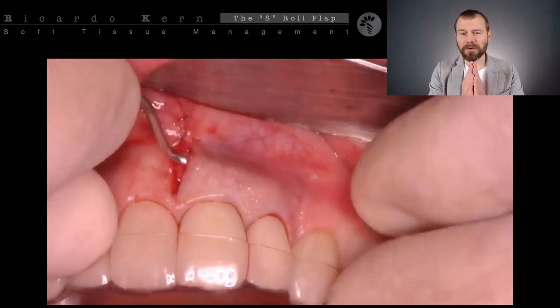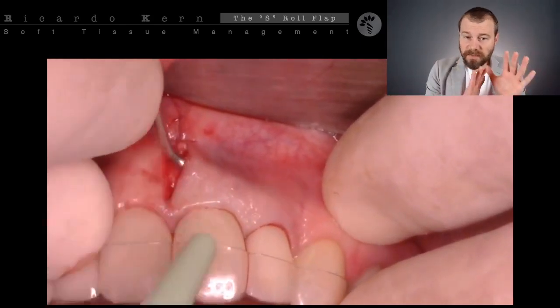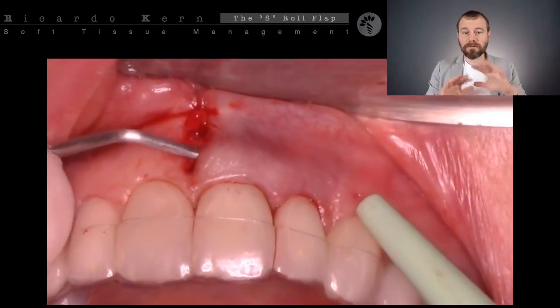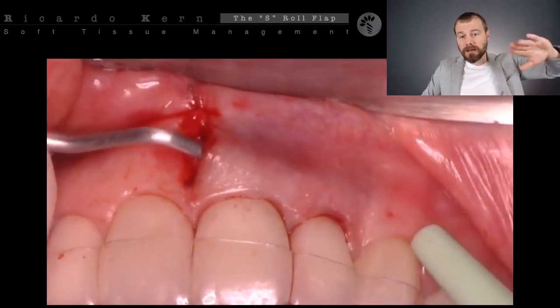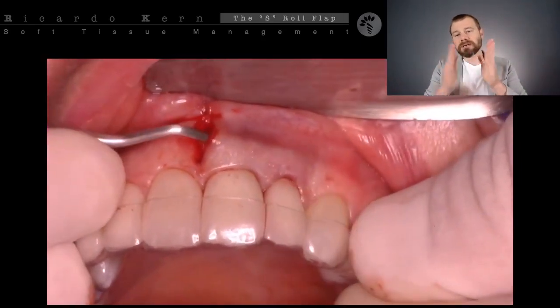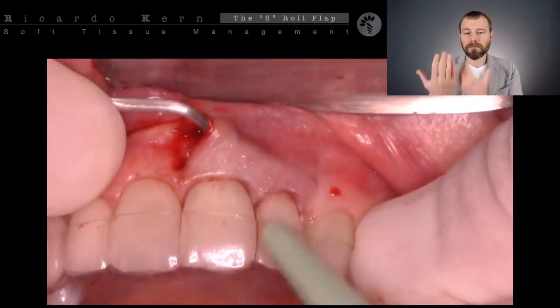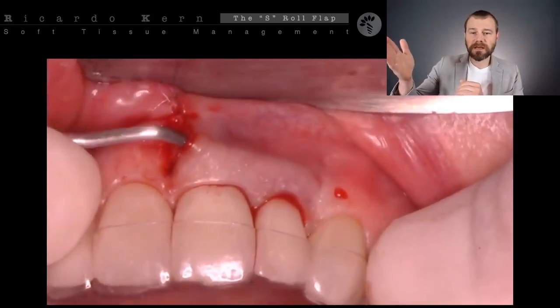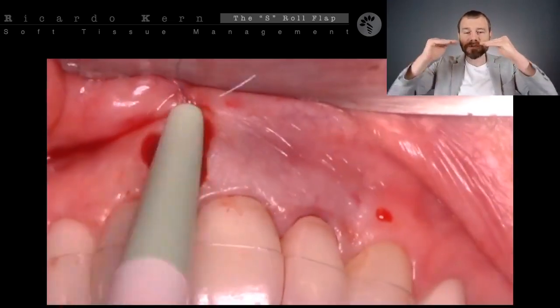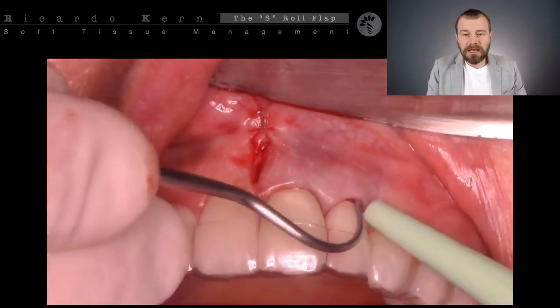And from that point on, natural roots, full thickness or split thickness. Go full thickness, okay? It's easier, safer for you to do the job, and you're going to just tunnel. That is easy, okay? And you're going to tunnel until the area that is not problematic in color. It means close to the canine. I do not need to release this tissue. The tissue is already in good position. I just need to open the space for my connective tissue to get inside.